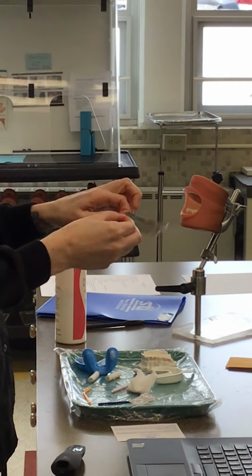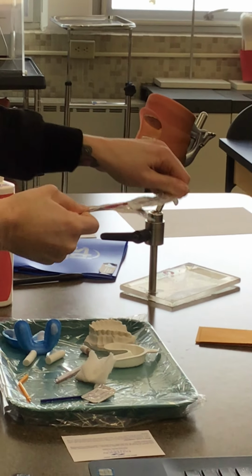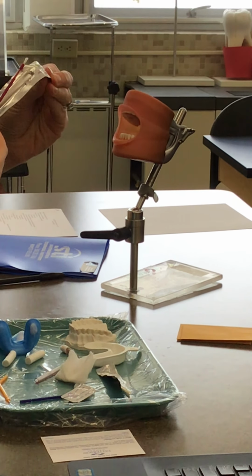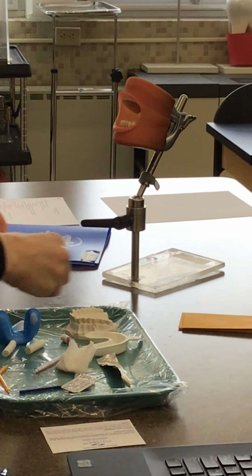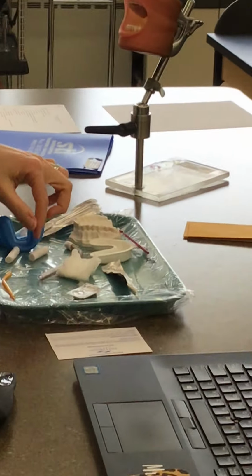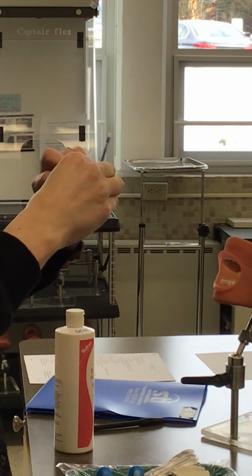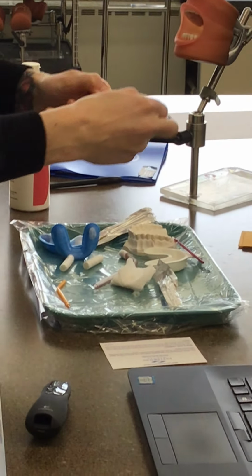This one is all self-contained, right? So it has the brush already in it, and then the fluoride is in this other well, but it's actually hardened because it's just old. I'm just showing you there's two different ways it could potentially be applied. This one's gonna come with a brush and a separate little well with the fluoride in it. So we're gonna open it. This one's nice and white.